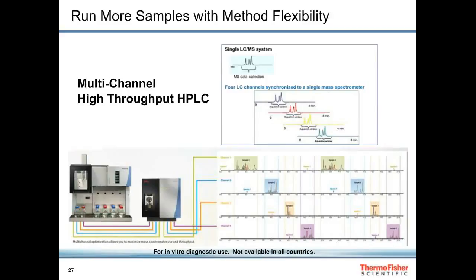Here we see what the Endura MD mass spectrometer sees as it keeps up with each channel of the Prelude LX4 MD HPLC running different methods across all 4 of its channels. In this case, the entire system achieves a throughput of about 22 injections per hour. Each channel has its own unique HPLC column and mobile phases, as well as unique data acquisition parameters for the mass spec. However, each method must have the same ion source temperatures so that there is no delay when switching between channels.